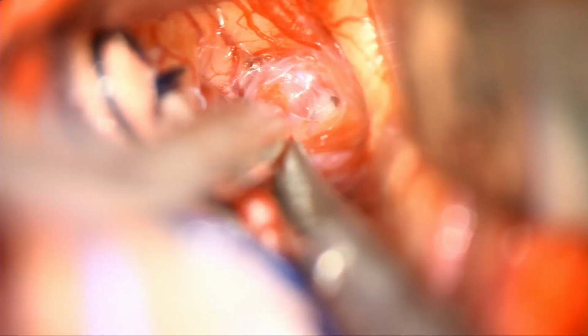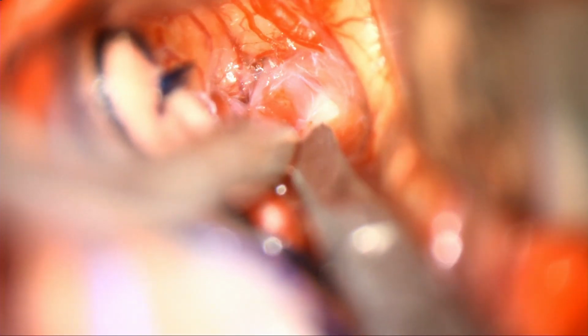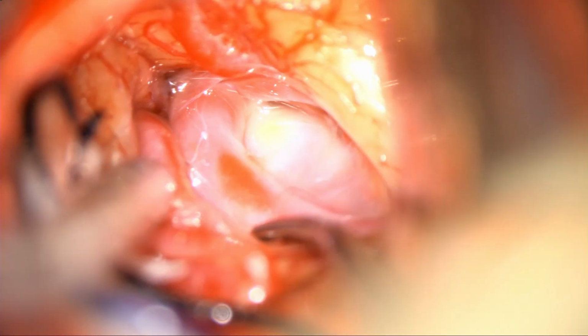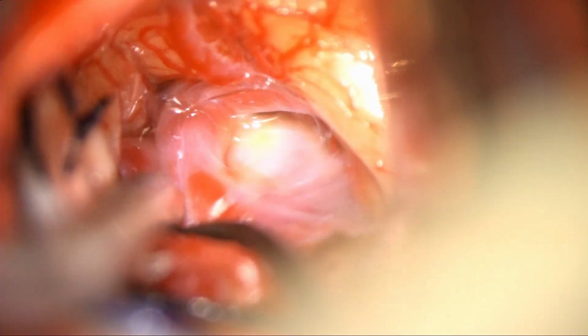As we continue to dissect, we are seeing a second bifurcation, and we are assuming that this is a bifurcation of the large anterior temporal branch. So the dissection is then continued, and we can now start to see some of the plaque in the wall of the aneurysm. And at this point, we still don't have proximal control. Therefore, we decided to separate the frontal and temporal lobe completely.